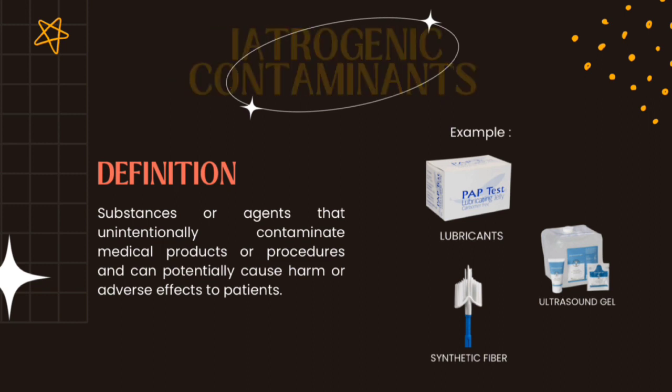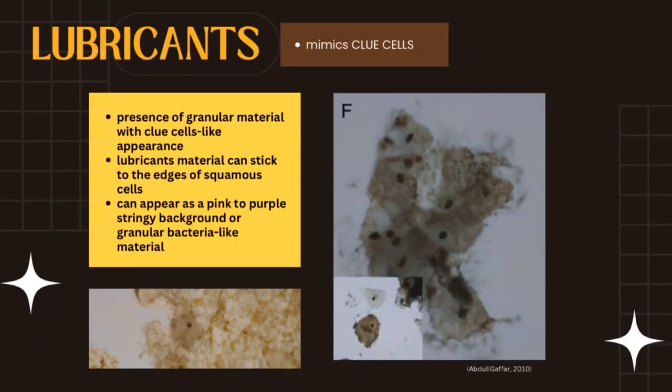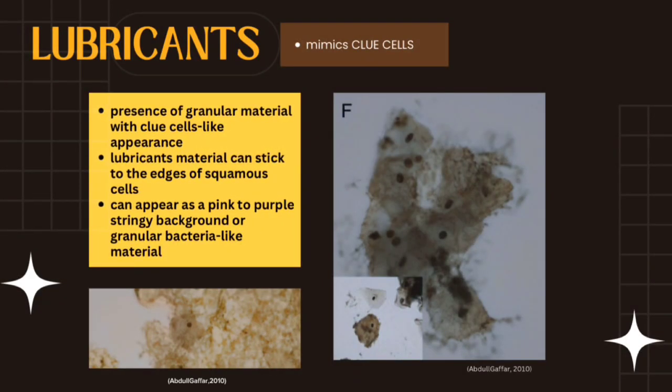This contamination may manifest as the presence of amorphous granular deposits. One example of a lubricant commonly used is Aquagel, which can present as a pale, lacy, and homogeneous material. Lubricants can sometimes mimic clue cells. Aquagel material can stick to the edges of squamous cells and can also appear as a pink to purple stringy background or granular bacteria-like material.